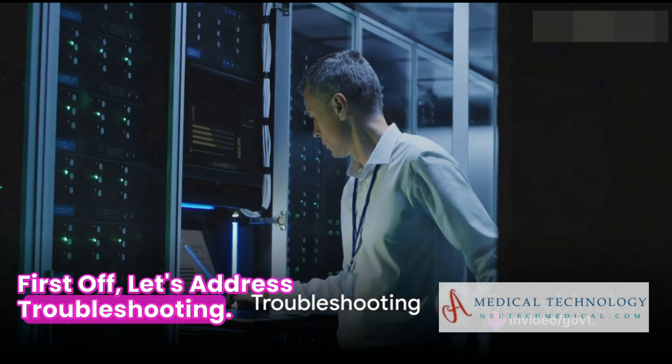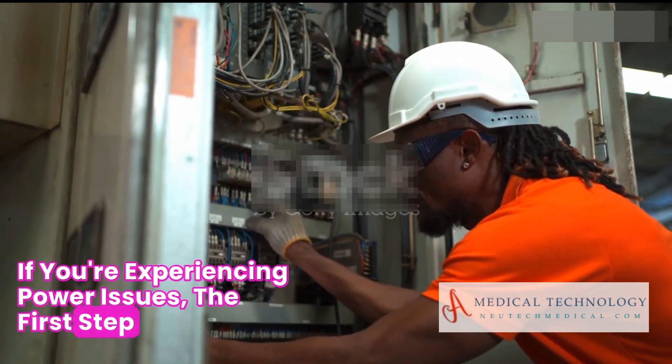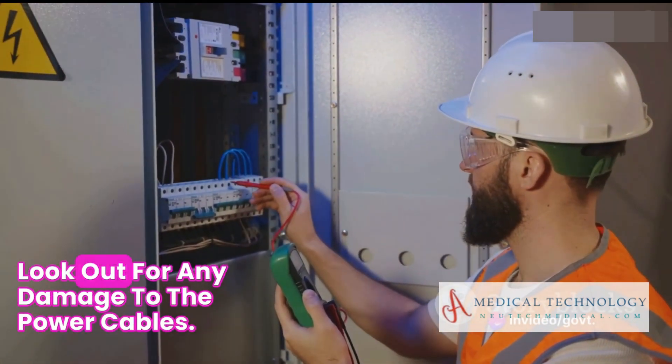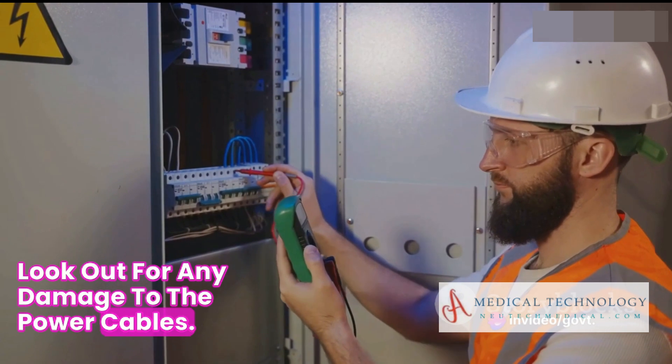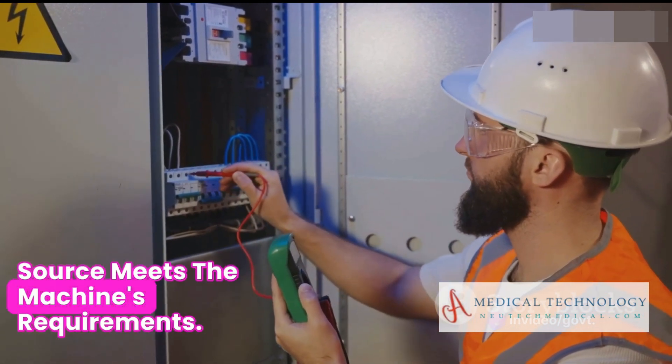First off, let's address troubleshooting. If you're experiencing power issues, the first step is to inspect the power supply and connections. Look out for any damage to the power cables. Also, ensure that the power source meets the machine's requirements.